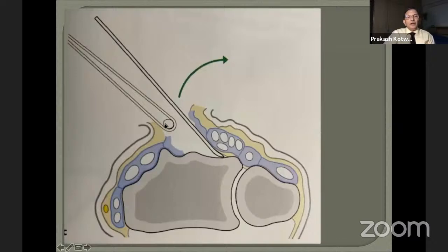Now this is the tendon of the extensor pollicis longus, which has been released from its sheath and has been retracted onto the dorsal side. And then with a periosteum elevator, you lift up the periosteum from the bone along with taking away the fourth compartment tendons. So you don't open up the fourth compartment, but you are now trying to reflect it onto the ulnar side. So you have now a direct approach to the dorsal surface of the radius without causing damage to the tendons.